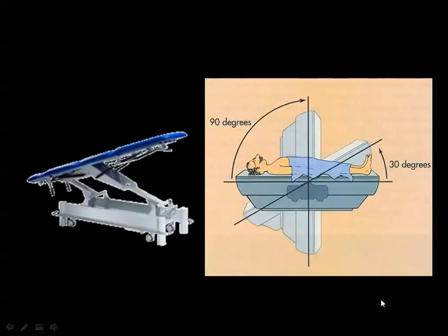Then after introduction of the contrast material inside the spinal canal, if you are aiming at the lumbar spine, then go ahead to have the radiographs in the supine and erect position. But if you are aiming at any other segment of the spine, you should tilt the table so that the contrast media will pass from the lumbar spine into the dorsal or the cervical spine.